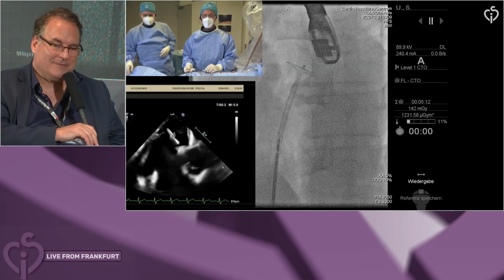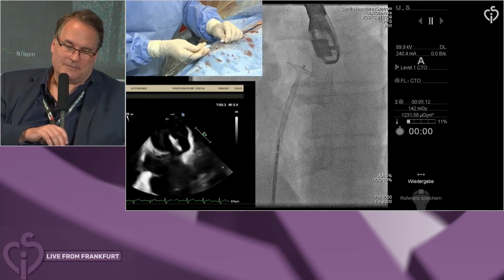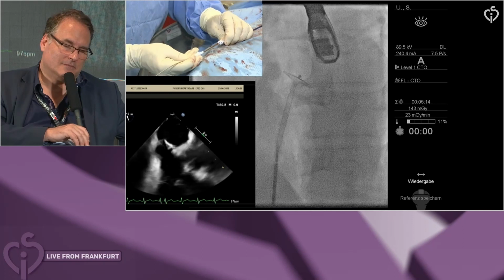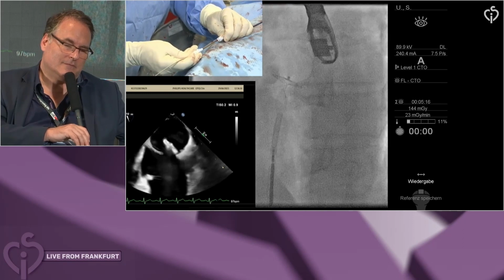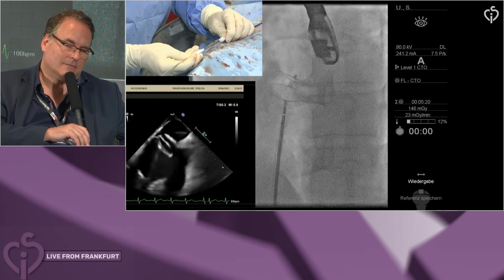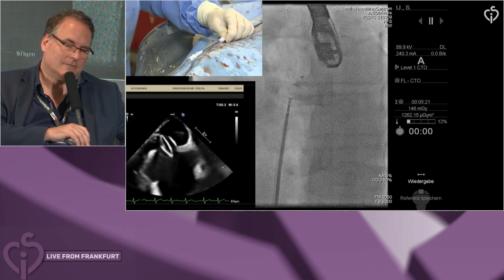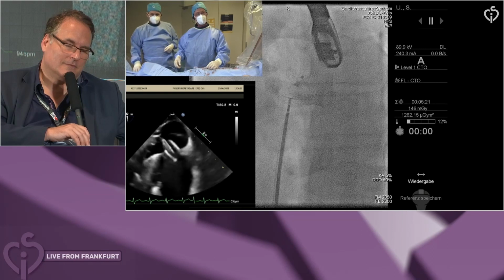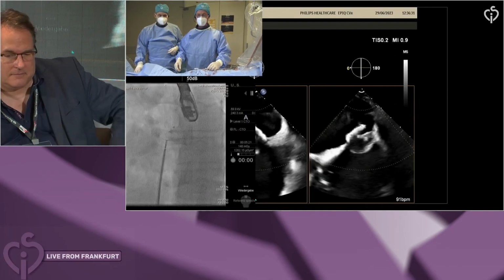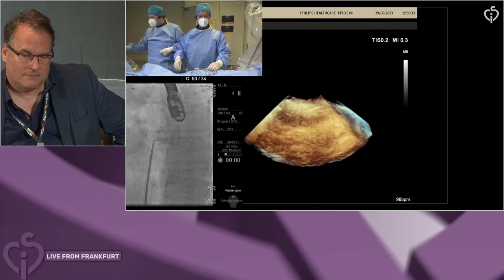Okay, so now I'm close to the septum and I look at the TE. It's now looking at TE and fluoro again. I'm pushing, pulling, it's aligned to the septum, and now this should be fine. I would release it unless Buscher tells me something differently. It looks really good to us. We can do a quick few checks, but I'm sure it'll all be fine.